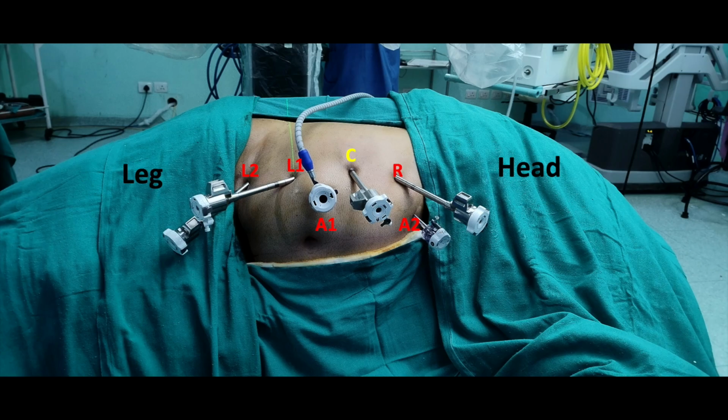A1 and A2 are two assistant ports. A1 is a 12 mm laparoscopic assistant port for suctioning and application of clips. A2 is a 5 mm laparoscopic port at the epigastrium. This is used for liver retraction.